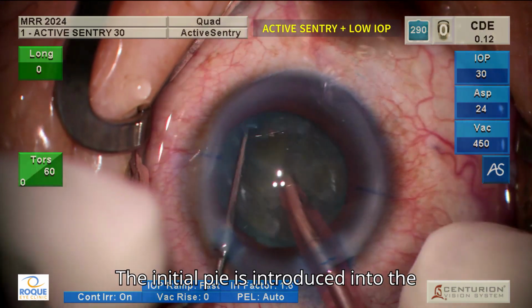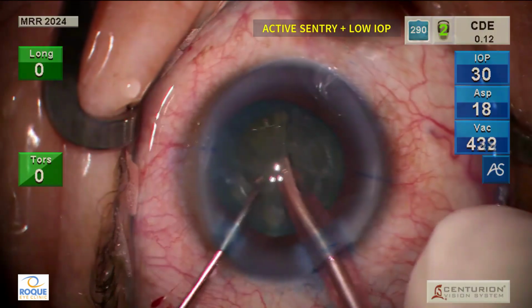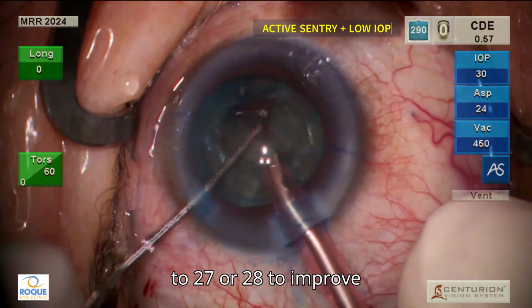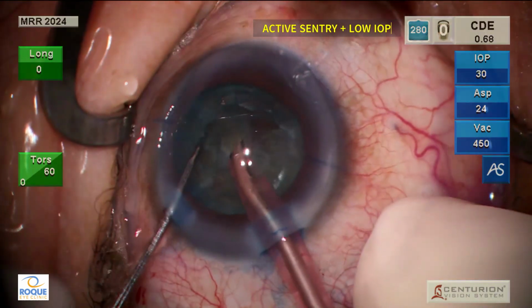The initial pie is introduced into the phaco tip and emulsification commences. The aspiration flow rate may be increased to 27 or 28 to improve followability without compromising chamber stability.